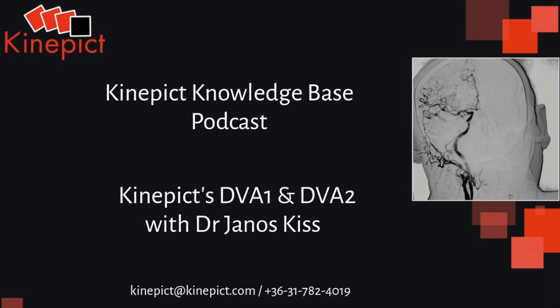additional manipulations is that the image will be much better in terms of signal to noise or contrast to noise ratio, and also the unwanted bone artifacts might be minimized. Blood vessels are visualized much better. So that was the major reason, and that was the aim. And we believe that finally DVA2 accomplished this task and performs better under certain conditions than DVA1.